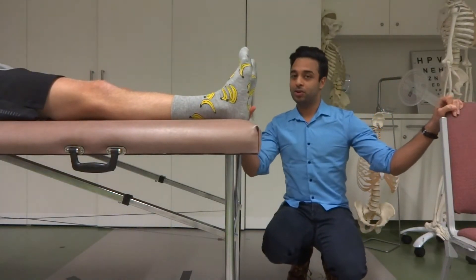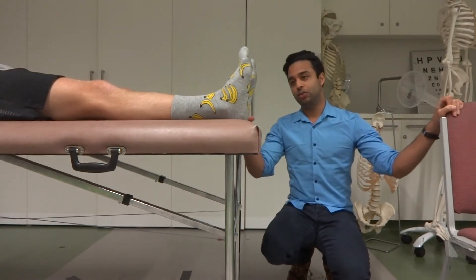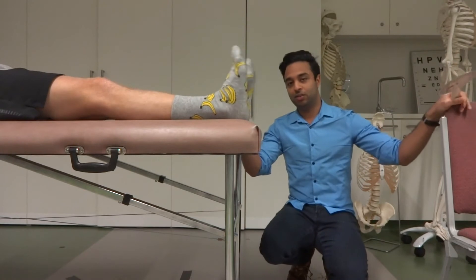Alright guys, I'm just going to do a quick video on ankle range of motion. We're going to do ankle plantar flexion and ankle dorsiflexion here with Jack today. These are Jack's feet in case you don't know.